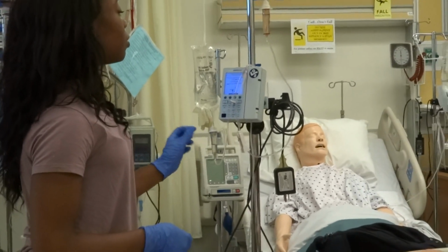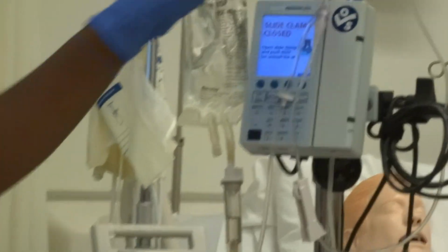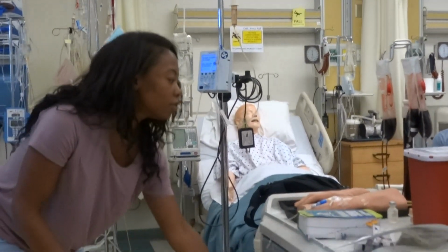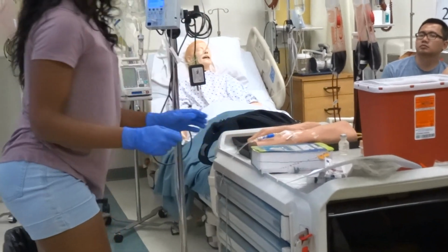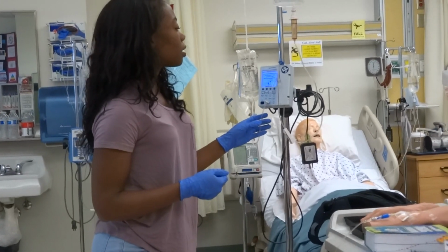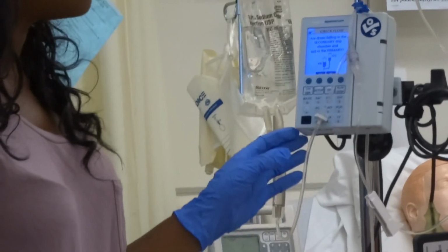It's going to ask you, are there drips? Well, what did I mess up on? The outside clamp. That clamp was closed. All clamps open, yes. And the very last clamp that should be open is the one that's closest to the patient. Always. That's how it's going to run, right? It's going to say, is there a drip going into the secondary?